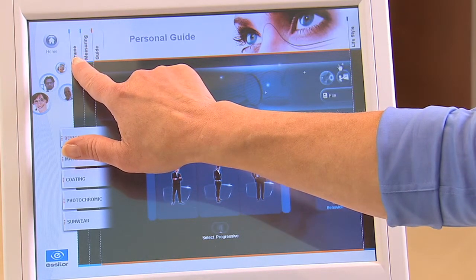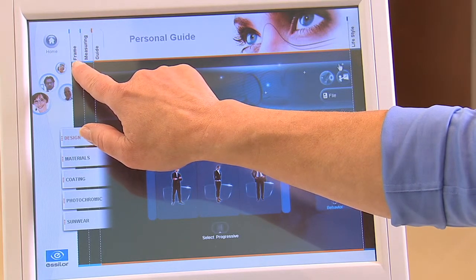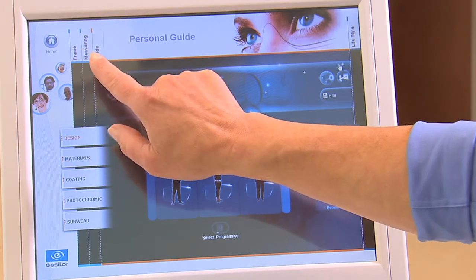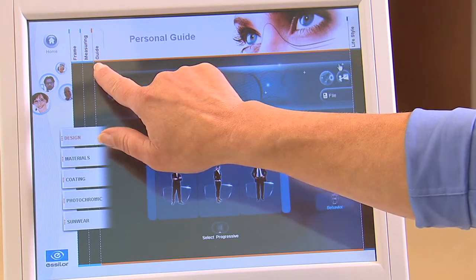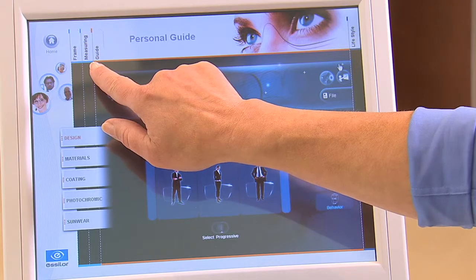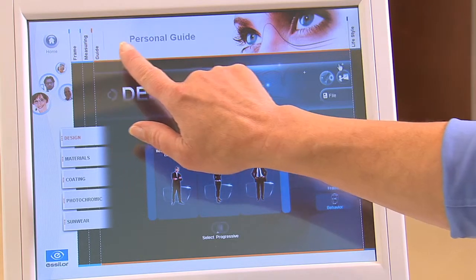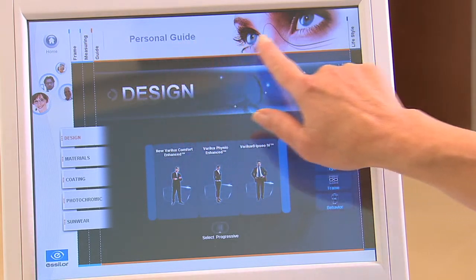You are now ready to navigate through the VisiOffice software. Using the vertical tabs at the top, you can move to the frame, measuring, guide, or lifestyle sections.